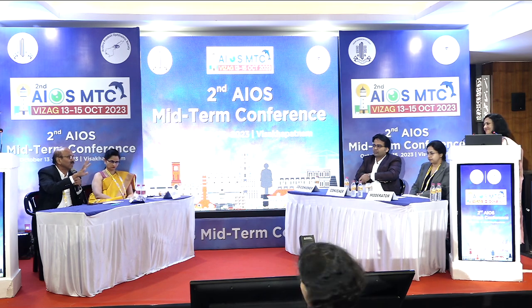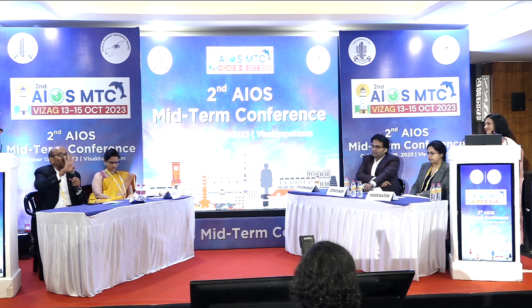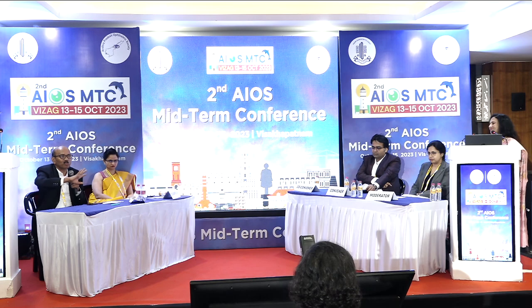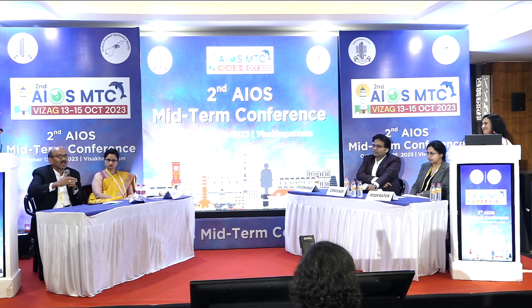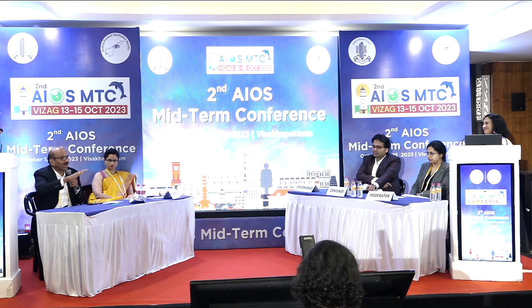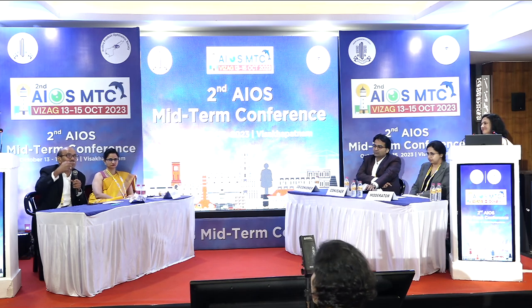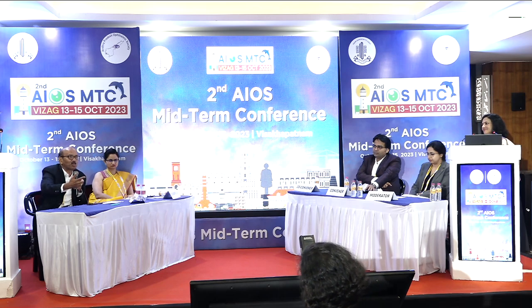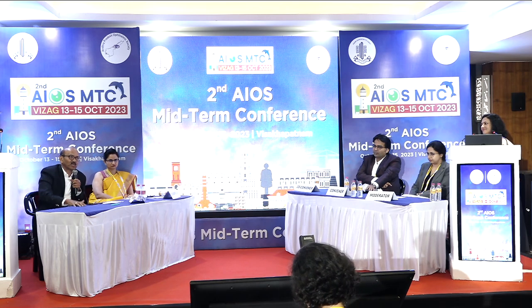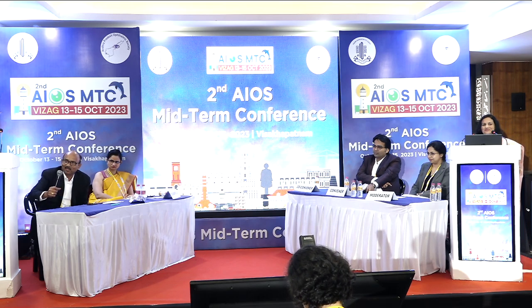But in high myopia, see, for example, when we started, the limit was 4. Beyond 4, no PRK. Then 6, then 7, then 8, then 11. You have to cut off at one stage, keeping in mind that in high myopes we have to use longer-duration steroids for a higher ablation. One line comment, sir.